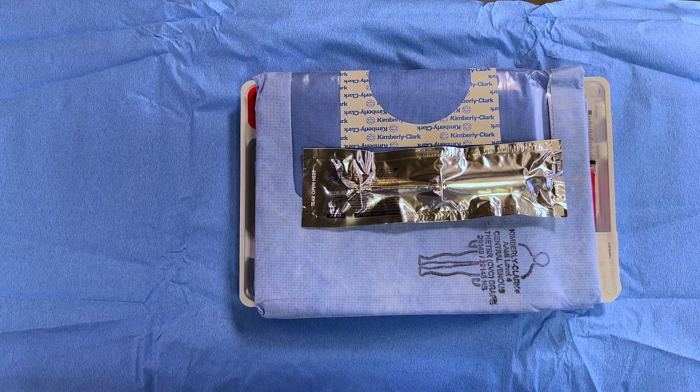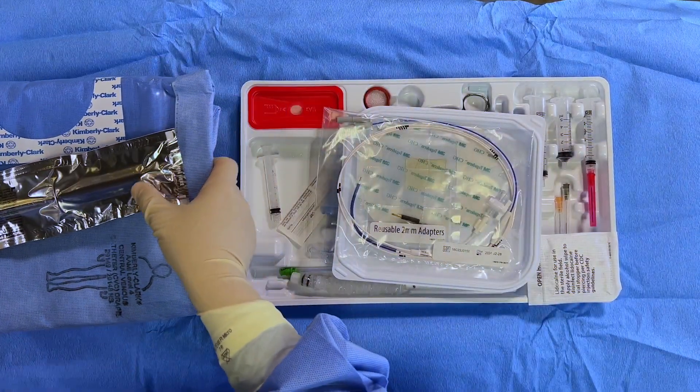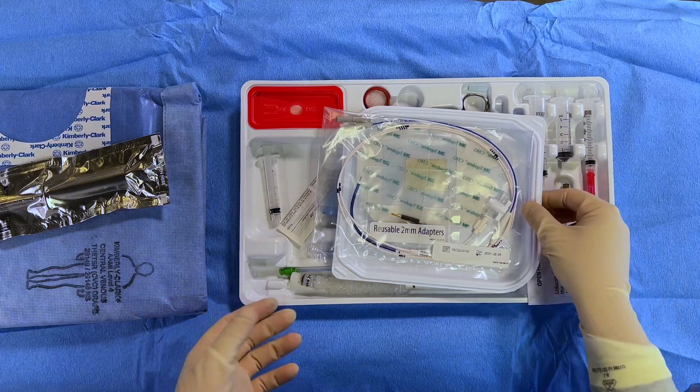In this video, we will review transvenous pacing using our new Transvenous Pacing Kit, which contains the essential elements for transvenous pacer placement, with the exception of sterile gloves.